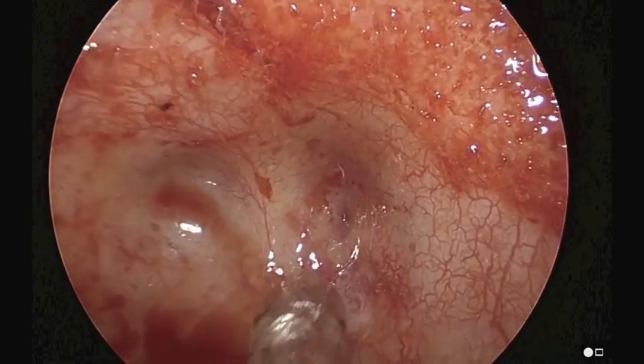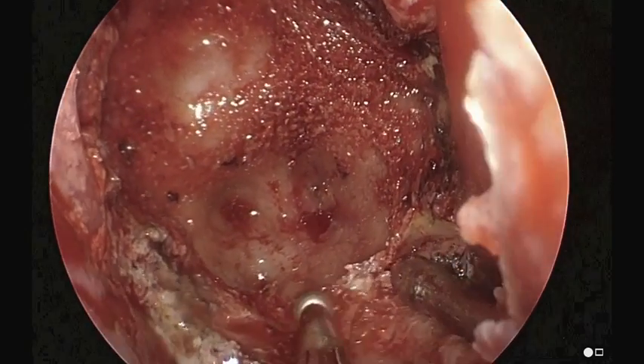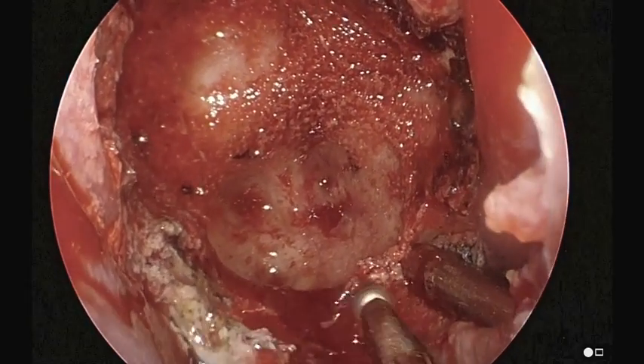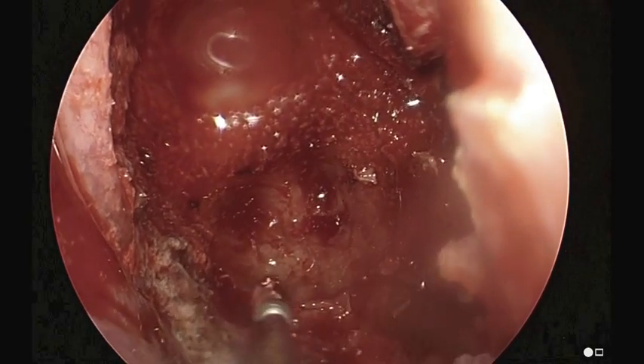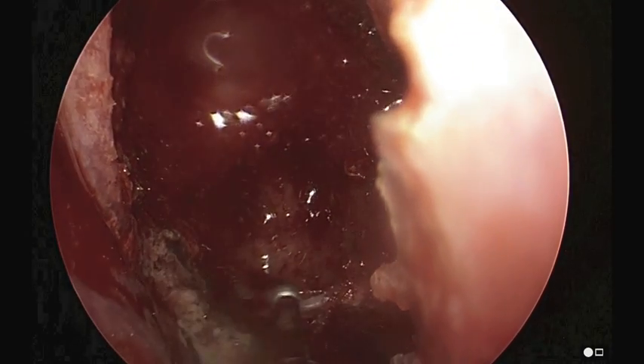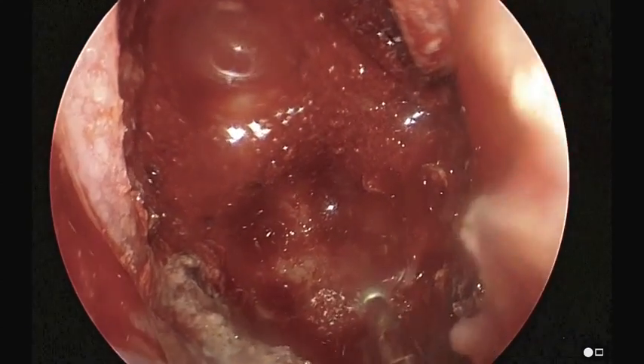We're going to be using image guidance throughout to help us view the apex of the granuloma and its entrance point. We have to drill down the anterior wall almost flush to the floor of the sphenoid sinus.